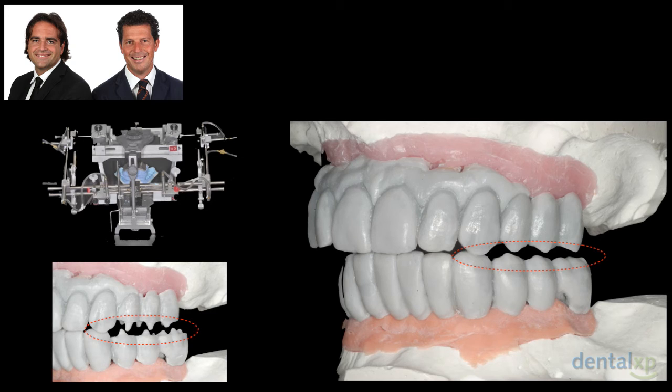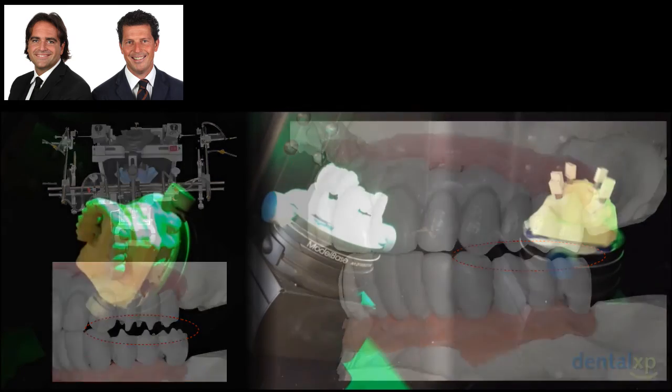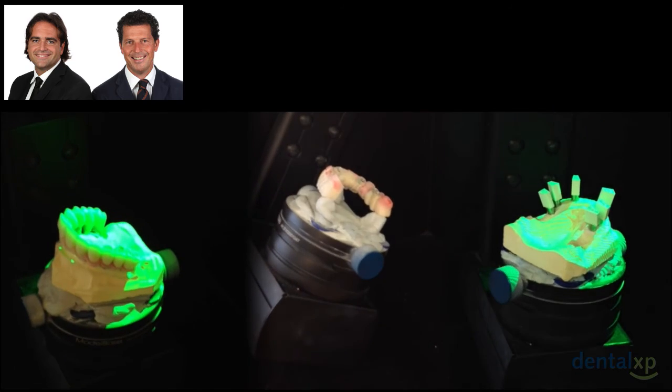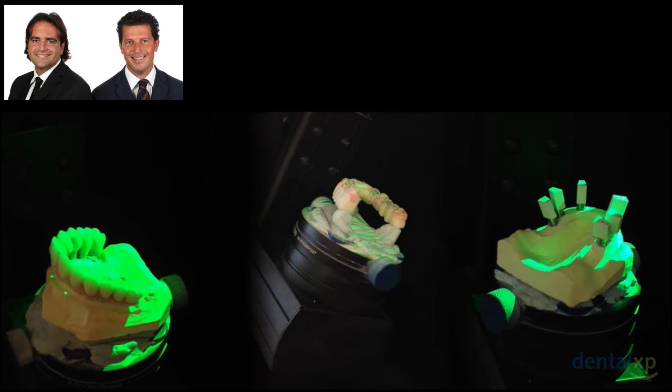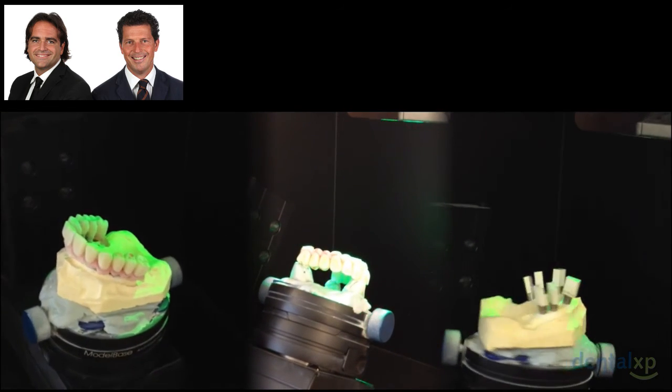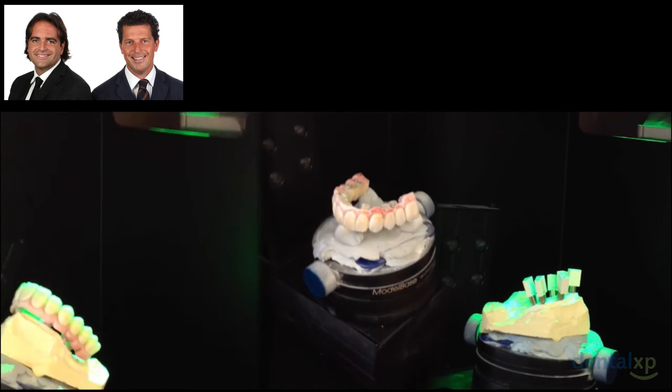And you can see here that Luca is working on the function, giving a sequential guide to the restoration, using all the traditional parameters, as for example the pantographic registration. When he's happy with it, thanks to the new scanners that are in the market, and this is the evolution, he can scan what he did, and he can have a nice work at the CAD.